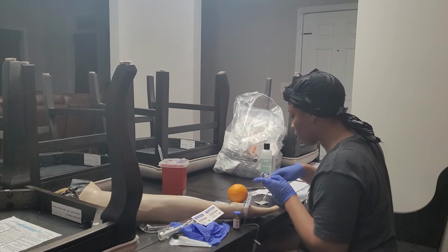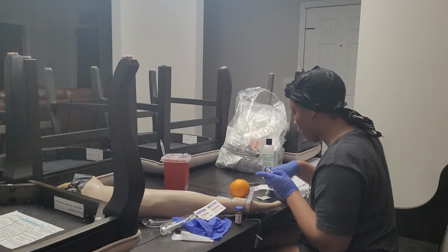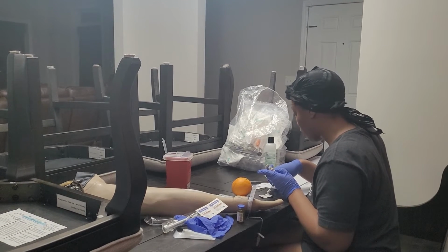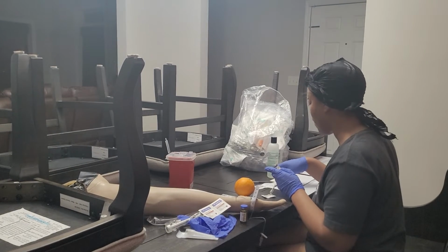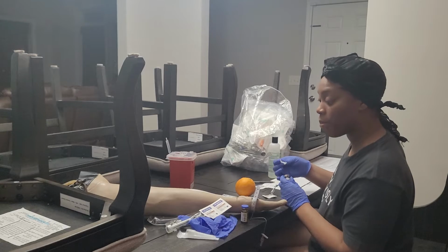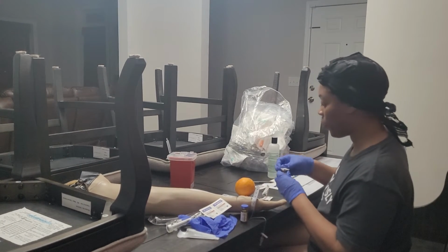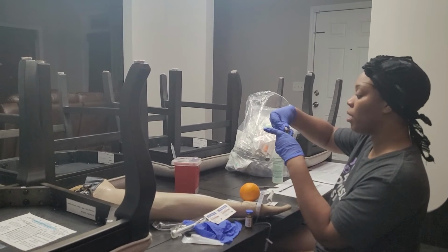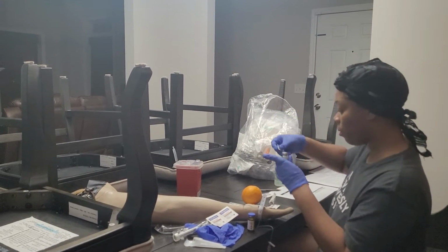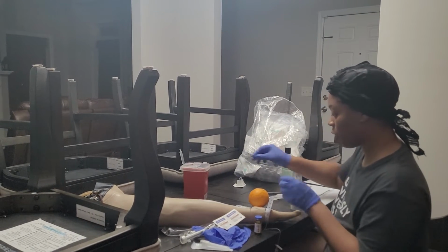Just double check, to be safe, that the patient is correct, Millie Larson, with the date of birth of 1/1/1936. And I'm confirming that Miss Larson does not have any drug allergies. And I'm going to ask Miss Larson again, do you have drug allergies? She tells me no. I am going to clean the top of my bottle. Put that, this is my trash.